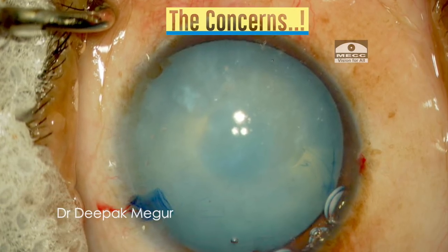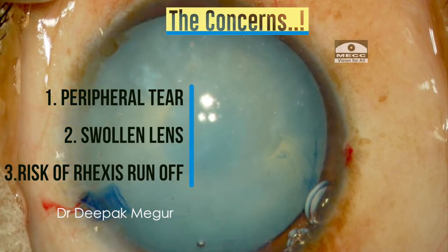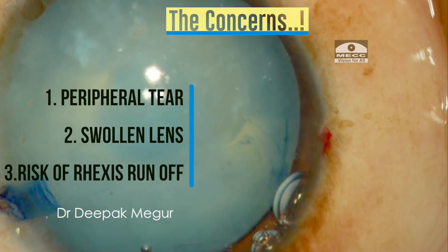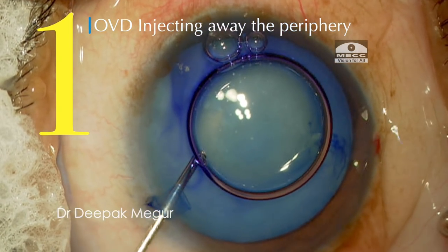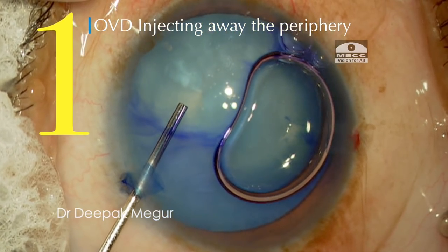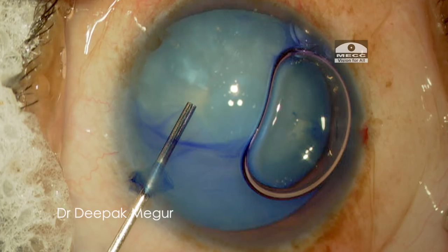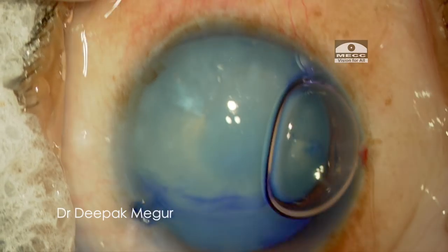Now, how do we manage this situation? The concerns are: the puncture is in the periphery, the lens is swollen, and there is a high risk of the tear running away to the periphery when we start to enlarge the opening. The first important tip is that while introducing the OVD, I ensure it is injected into the periphery of the anterior chamber far away from the area of the puncture. This prevents OVD from entering the bag and increasing the intracapsular pressure. The trick is to inject it far away from the site of puncture.